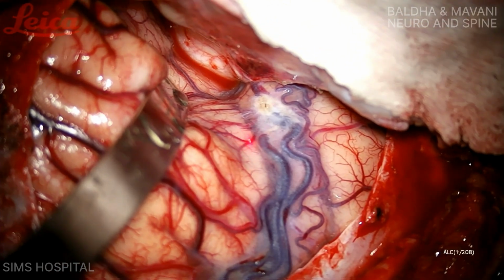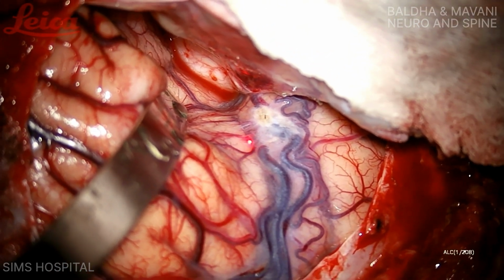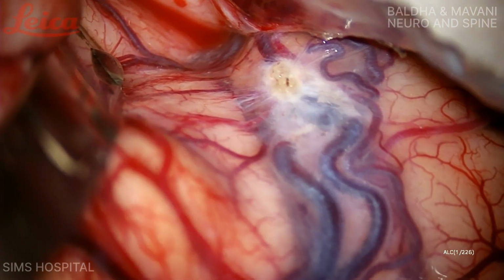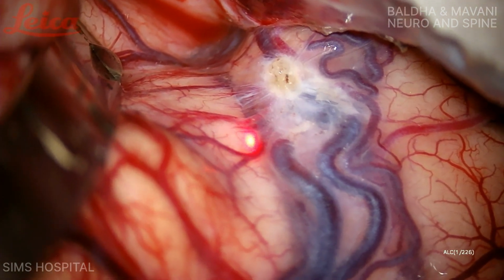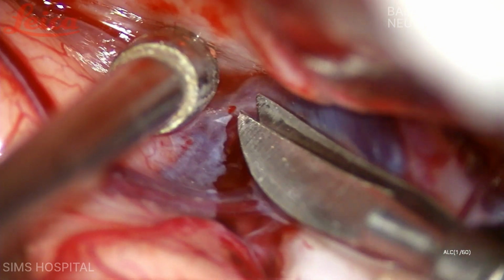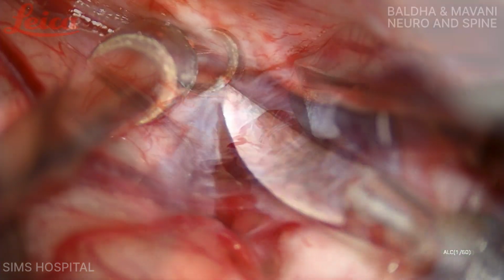Now I am going to demonstrate the surgery. This is the microscopic view of the right frontotemporal lobe and the sylvian veins. The sylvian fissure was dissected and opened to gain wide space around the carotid artery.